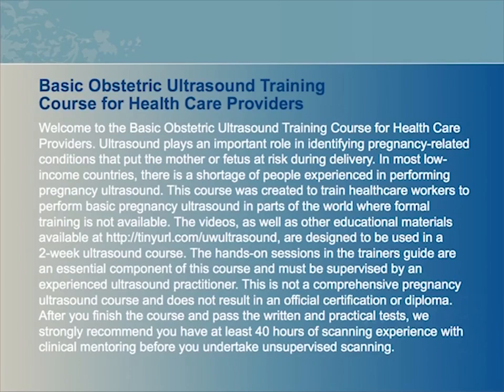The videos, as well as other educational materials available at tinyurl.com/UW ultrasound, are designed to be used in a 2-week ultrasound course. The hands-on sessions in the trainer's guide are an essential component of this course and must be supervised by an experienced ultrasound practitioner. This is not a comprehensive pregnancy ultrasound course and does not result in an official certification or diploma. After you finish the course and pass the written and practical tests, we strongly recommend you have at least 40 hours of scanning experience with clinical mentoring before you undertake unsupervised scanning.